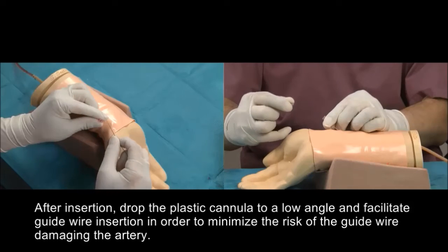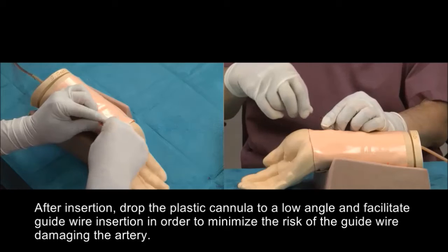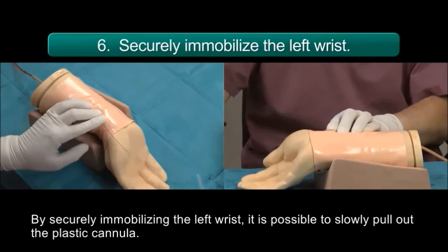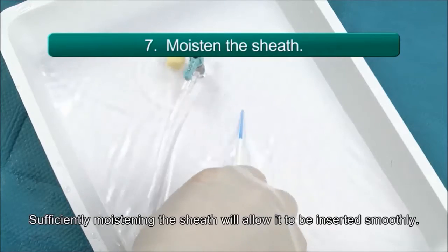After insertion, drop the plastic cannula to a low angle and facilitate guide wire insertion in order to minimize the risk of the guide wire damaging the artery. By securely immobilizing the left wrist, it is possible to slowly pull out the plastic cannula. Sufficiently moistening the sheath will allow it to be inserted smoothly.